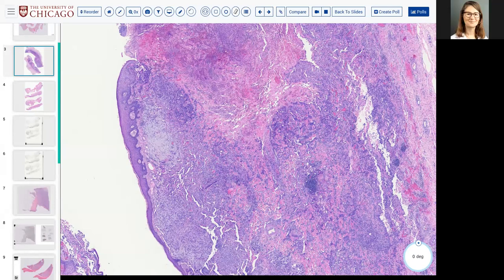Because I think once you start saying lymphangio, you almost imply that there's lymphatic differentiation. And in some vascular lesions, you can actually have D2-40 expression, which implies some kind of lymphatic differentiation as well. But mostly we don't tag the two exactly. Okay, did that all make sense? Are there other questions?